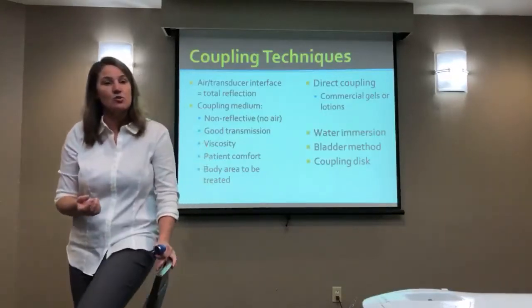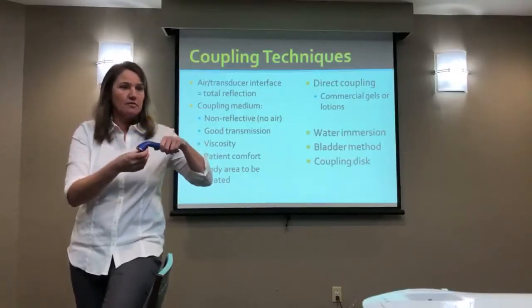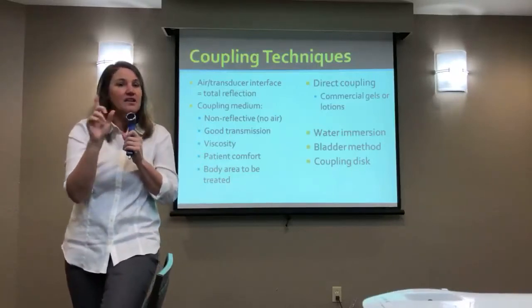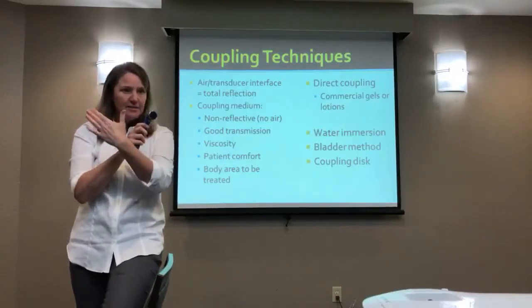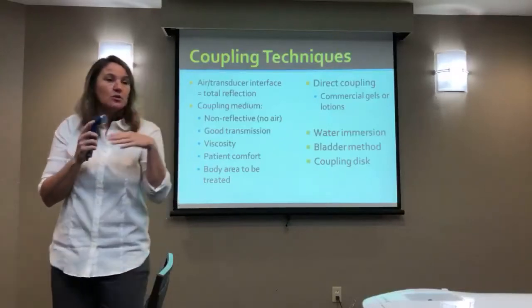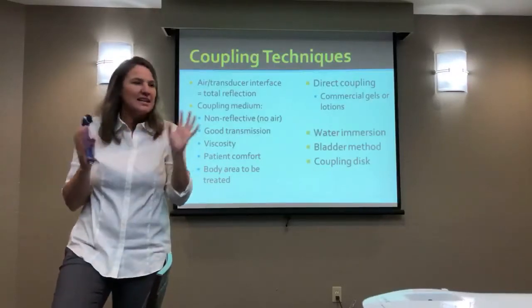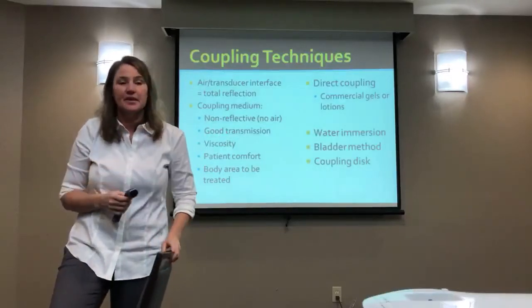I did think it was a kind of cool idea to take a condom-type cover. If you picture a rubber tube that you would put over the head, and if that was filled with gel, that's kind of a cool idea. If you took a firm head that's flat and you turned it into a conforming one. So you said you do hand therapy, right? So it would be kind of cool to have a bulbous, flexible head that you can move around. So the idea is cool. I don't really need the idea for where I work clinically, but it's kind of a neat idea.